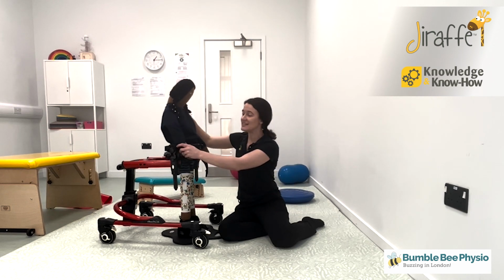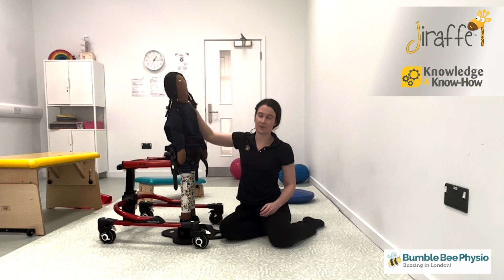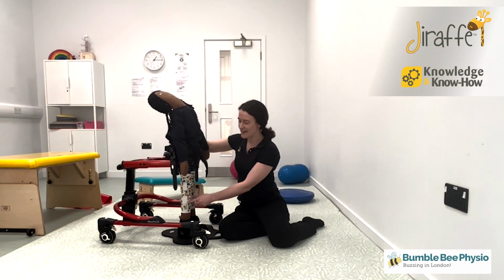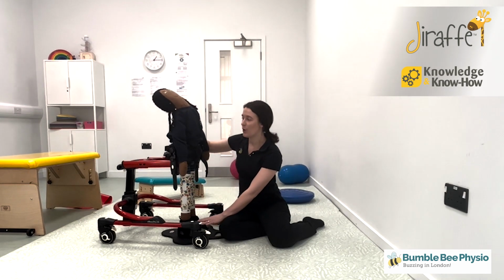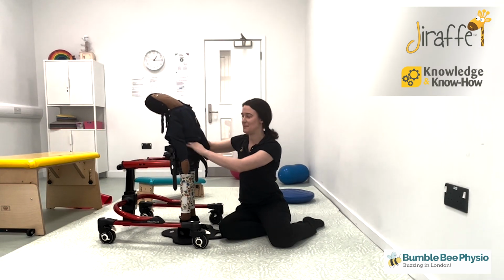So children will need to have some sort of trunk control to be able to do this, unlike my model right here. And so we are going to have knee extension with the gaiters on, feet flat on the floor or with AFOs, and then this is coming all the way right down to the hips, as you can see here.